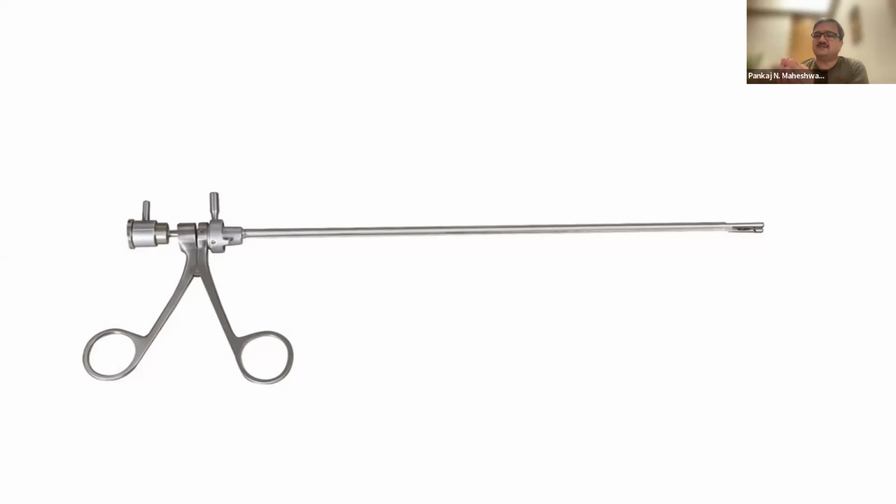Those sharper edges will cut the tissue, and in that cup the tissue doesn't get crushed or compressed. It is like doing a punch biopsy. That particular area is cut all around, and what is accommodated in that gap only will be removed. So the tissue will not get stretched or torn. Yes, sir.